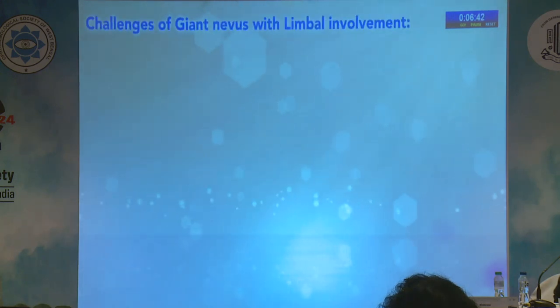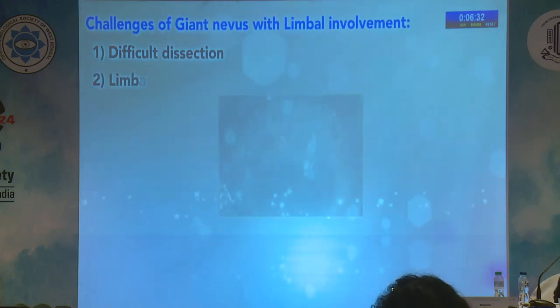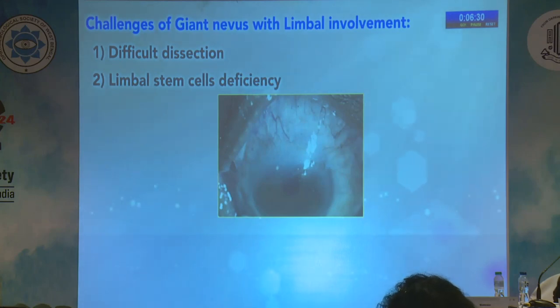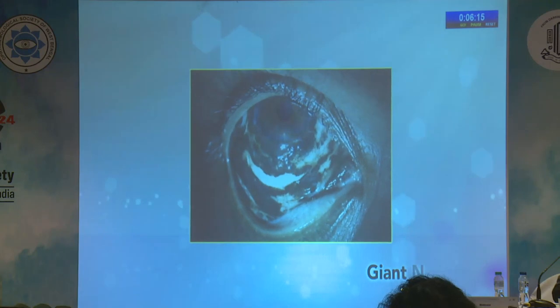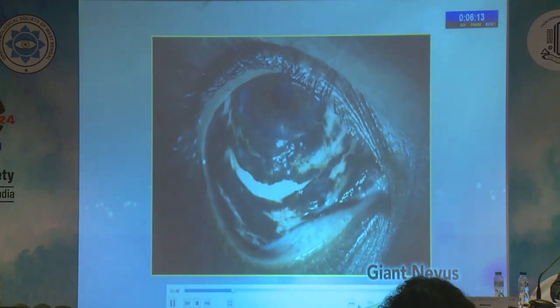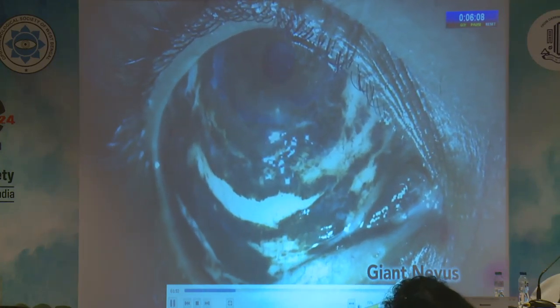Managing such giant nevi with deep limbal involvement has several challenges. Firstly, extensive dissection while keeping a safe tissue plane may be difficult. Secondly, there may be chances of limbal stem cell deficiency after larger limbal mass removal. And lastly, closure of such a large defect usually requires amniotic membrane or mucous membrane graft or use of synthetic materials. This video will demonstrate excision and outcome of one such recurrent, histopathology confirmed case of giant compound nevus.